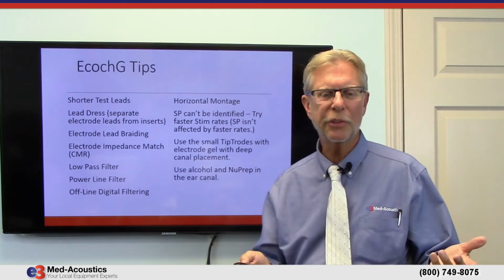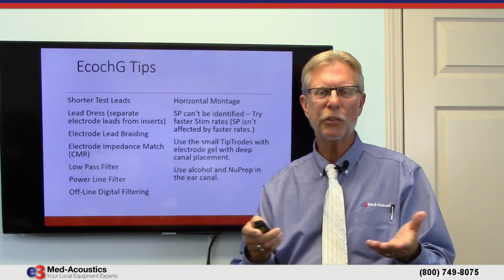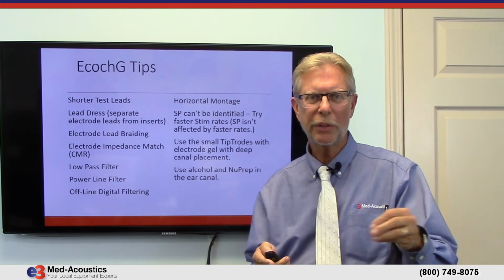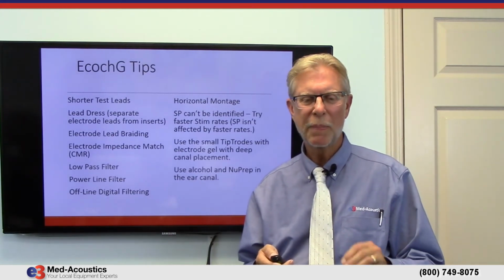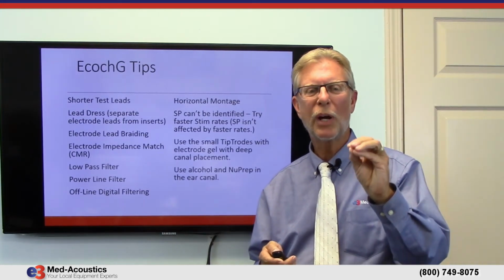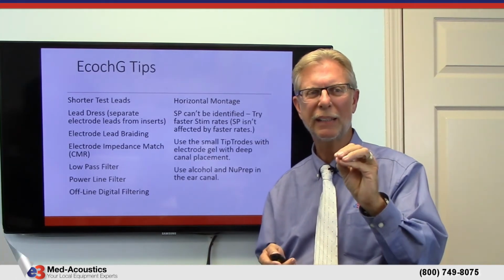So those are the tips that will help anybody who's already doing this test, and we hope that this presentation has helped you in knowing all the alternatives and giving you some tips that will improve the results that you're getting. And now what we're going to do is we're going to use the Interacoustics Eclipse. We're going to show you how we actually apply the electrodes. We're going to do the test and show you how we analyze the test.